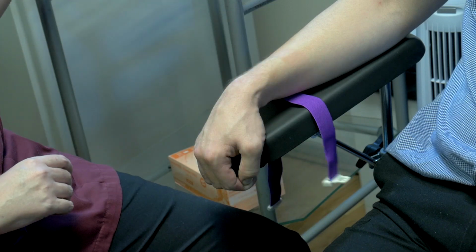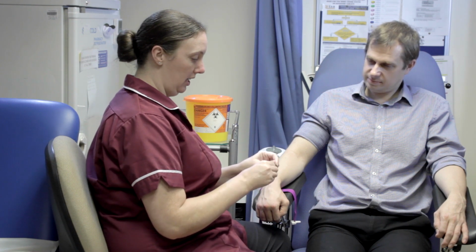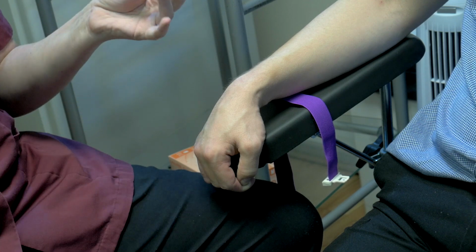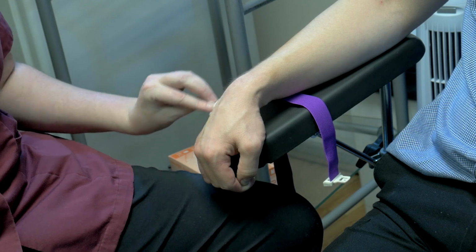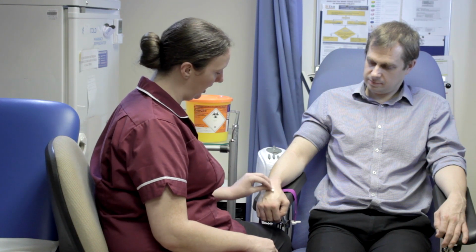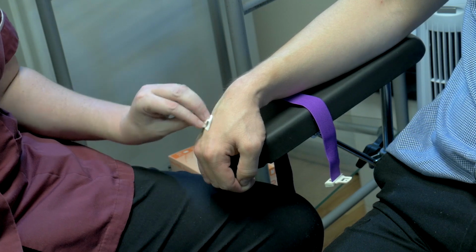So next I'm going to clean my patient's hand. We just get our prep swab out and ball it up a little bit, and starting in a circular motion, we start small and go outwards. We want to cover all the potential sites that we may take blood from. We should be doing this for about 30 seconds.